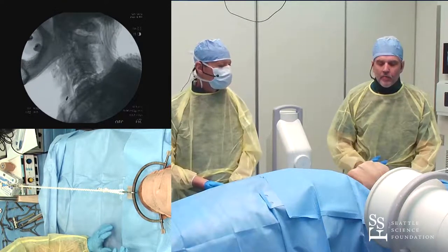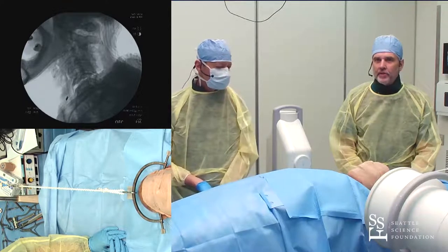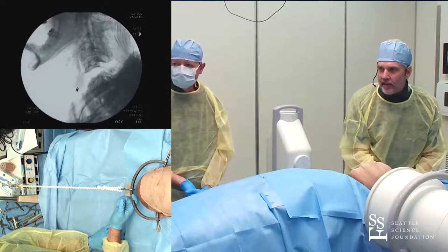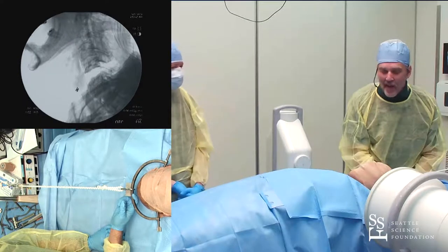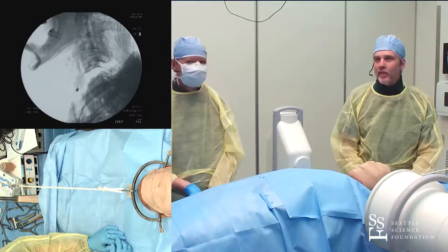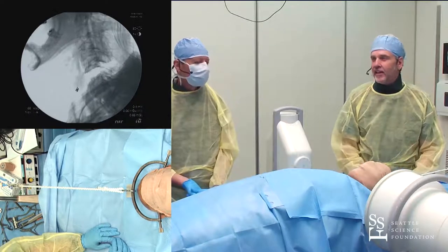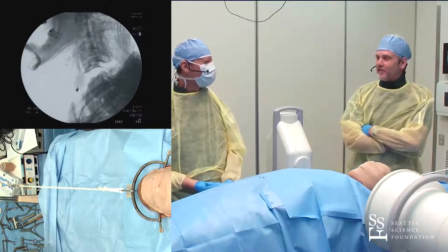Before adding any weight, I'll do a quick C-arm check to make sure we're not already over-distracted. One of the problems when you start putting on weight is over-distraction — and we just demonstrated that with about five pounds of traction. That's one of the contraindications to using traction: a pure distraction injury like this. So start with only low weight — five pounds.